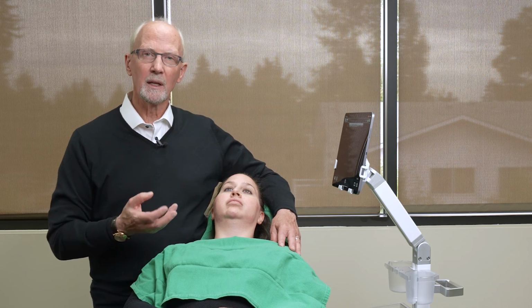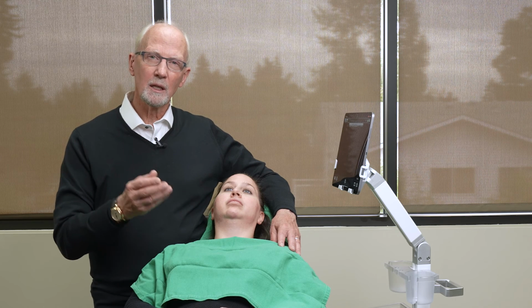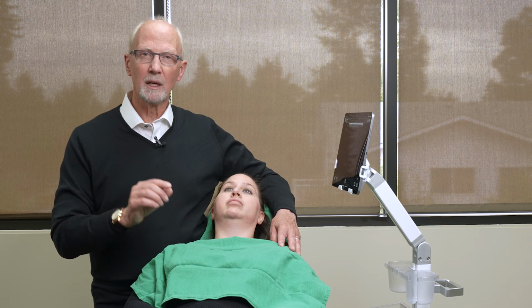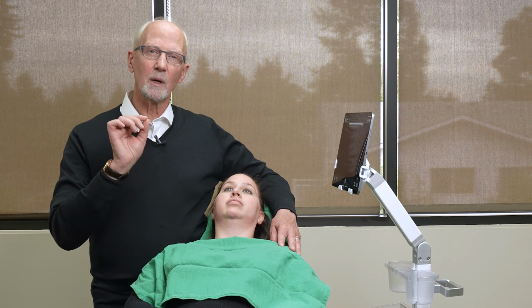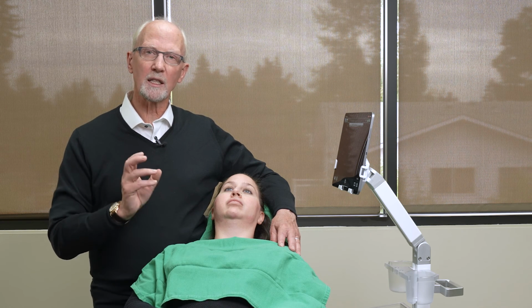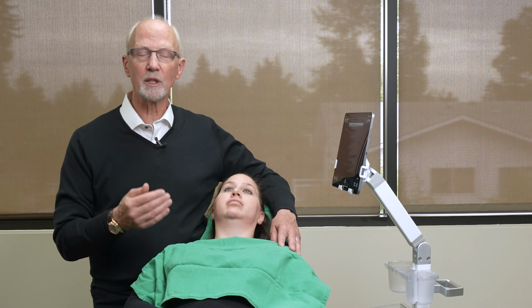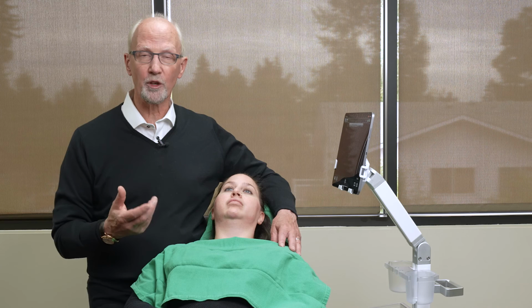We then looked at the product after it's been placed to see the volume that's put in, its distribution within the tissue, the amount, the location, so that you can now use your ultrasound after treatment to look at your patients to document that the product is in the location that you wanted it to be in order to accomplish the improvement that you were looking for with your patient.